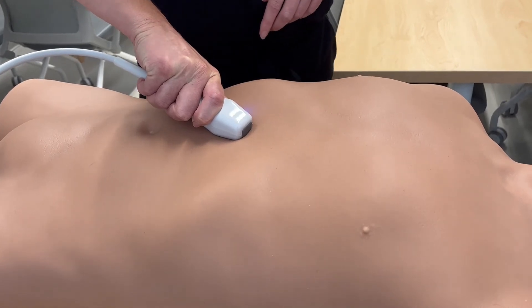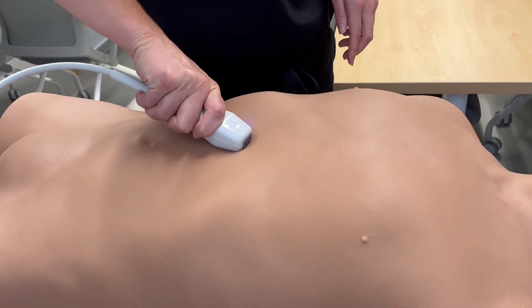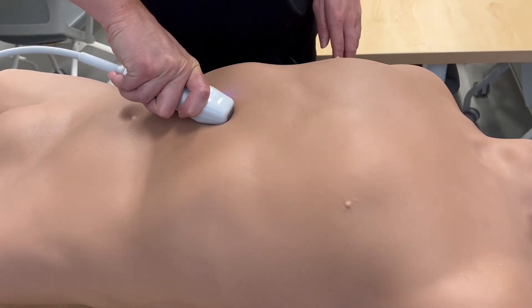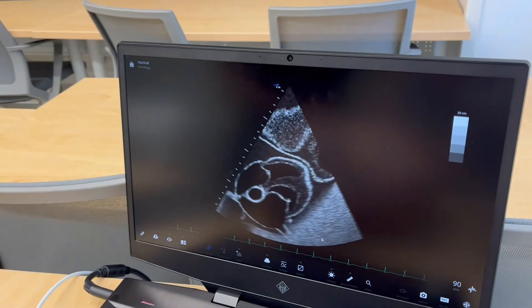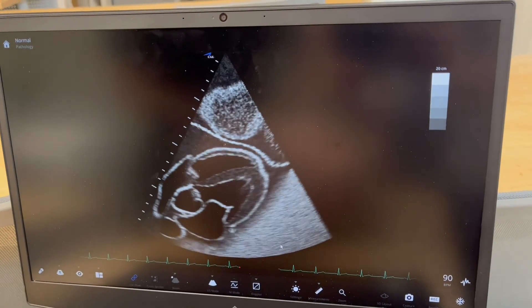This view is nearly impossible if your patient is sitting straight up, or if they're particularly obese or have a distended abdomen. To obtain this view, you'll need the patient lying supine and you will need to apply pressure into their abdomen. The view we're looking to obtain shows all four chambers of the heart on the screen.